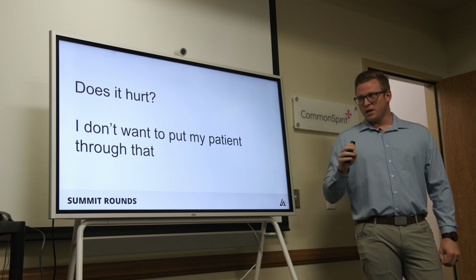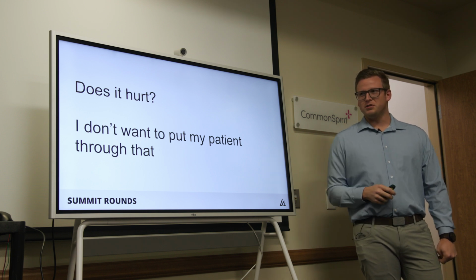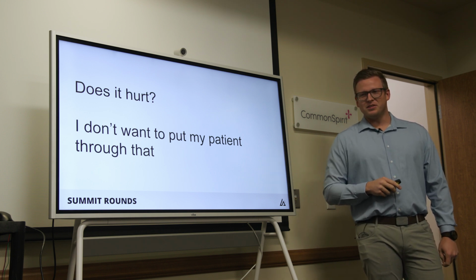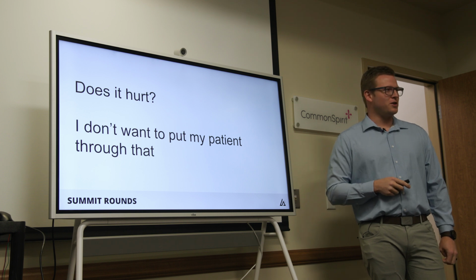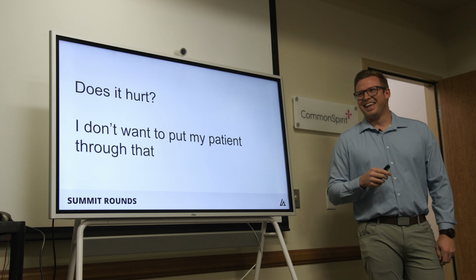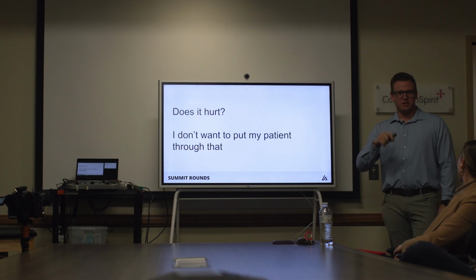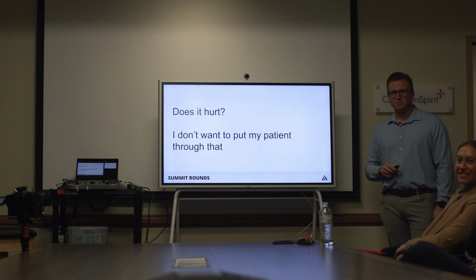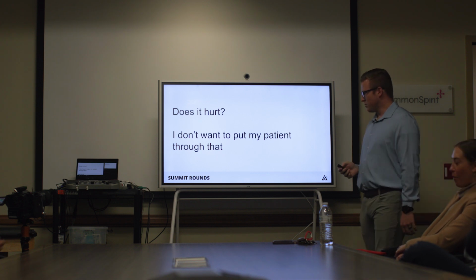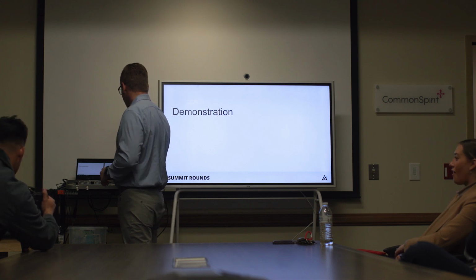So with that said, we're hoping to answer a lot of this by demonstrating. Brandy was kind enough to volunteer, and she can tell us a little bit about her experience after. And then no judgment if there's tears. I've also done a demo on Tyler and Alex, so feel free to chime in on your experience as well. So with that, we'll jump right into the demonstration.